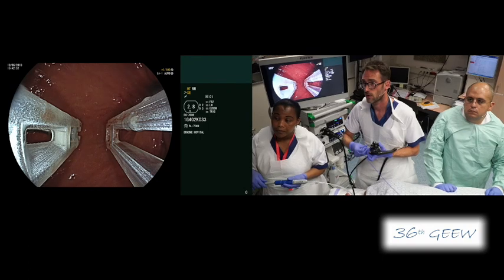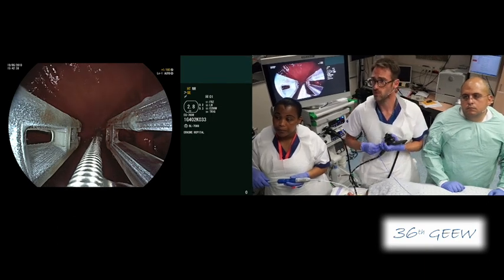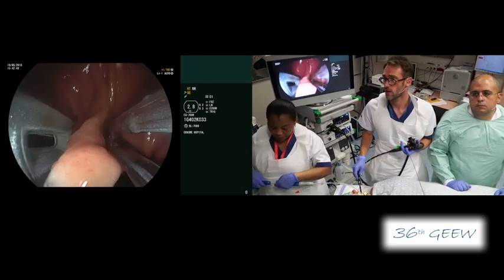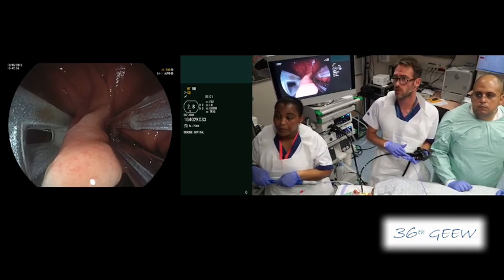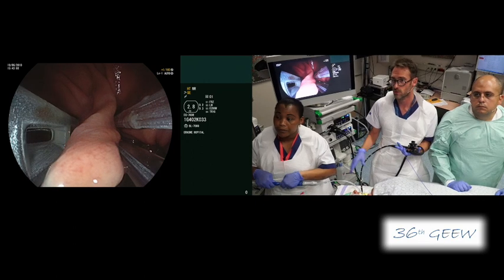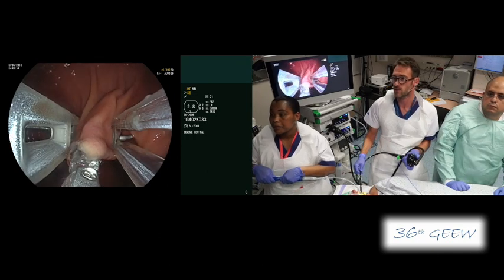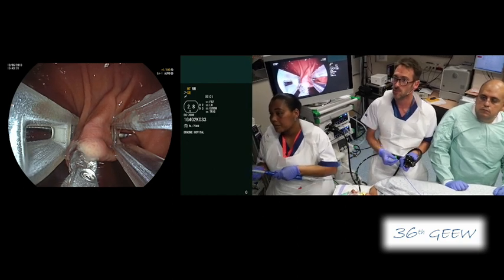Just slowly and gently. Now I will grasp the tissue just in front of me — close, pulling back — grasping a lot of tissue to be sure that we have a full thickness piercing. I have the impression this grasper is relatively large — it's a raptor forceps, a mix between a rat tooth and a biopsy forceps. It's commercially available. We are trying to use commercially available tools like a small monofilament snare, and of course a big one to grasp a lot of tissue and apply some strength to have a lot of tissue between the two arms of the device.